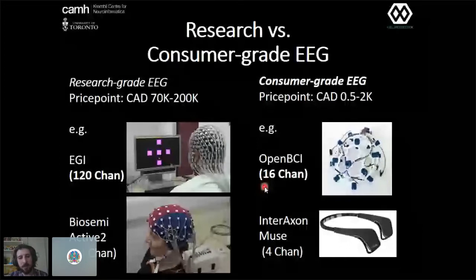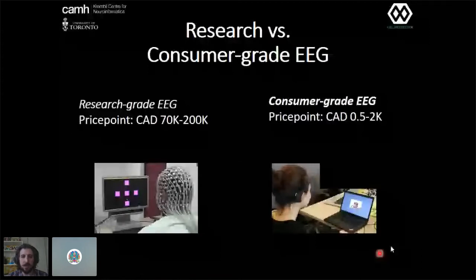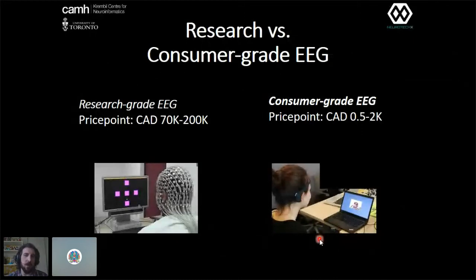Another aspect of what I was just describing is that it's not just the systems, but also some of the associated peripherals. Being able to run your experiment on a standard laptop with an open source, relatively recently developed stimulus delivery software stack are other enabling factors for the type of things I'm going to talk to you about now, which have really emerged in the last 5 years or so. It wasn't the case 15 years ago that you could do these things. Even if you had the hardware, the software ecosystem wasn't available, but it is now. And we're trying to build it even further.